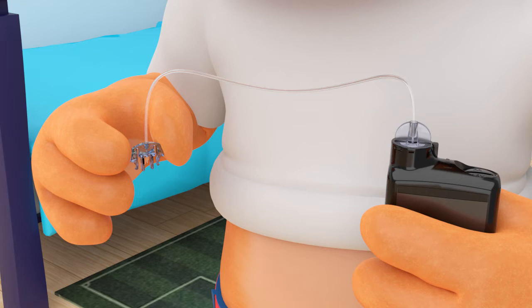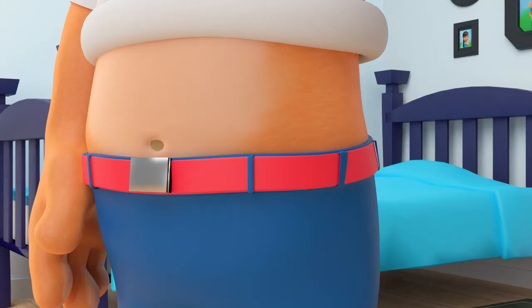Then you fill the tubing with insulin using your pump until you see drops coming out. Your parents can show you how exactly to do this. Now place the new infusion set on your body. It's important to remember that the new infusion set needs to be placed in a new space on your body.